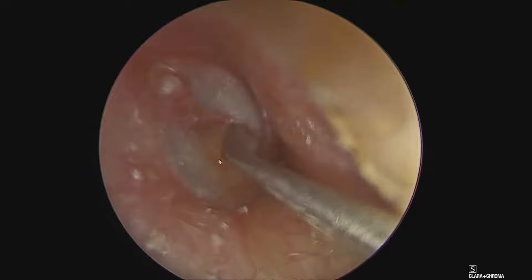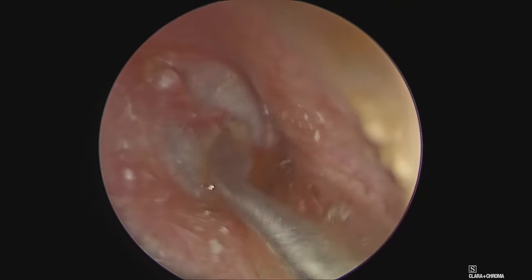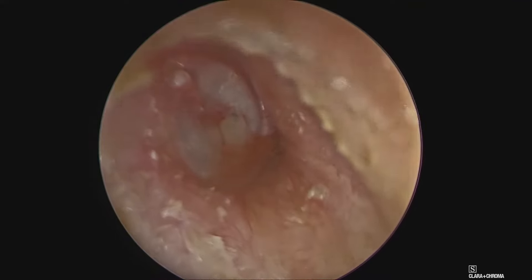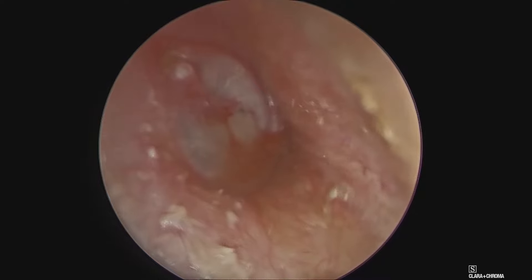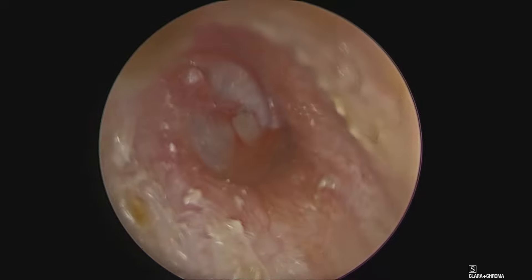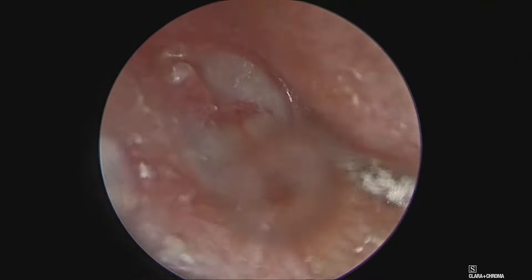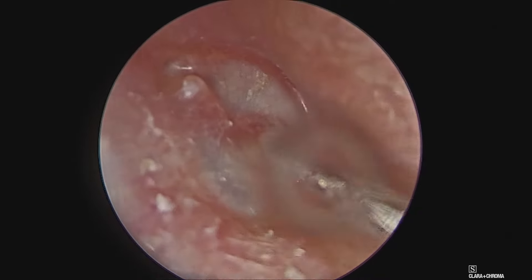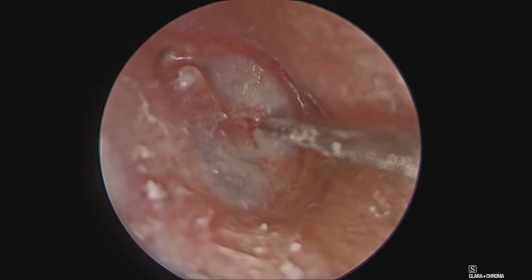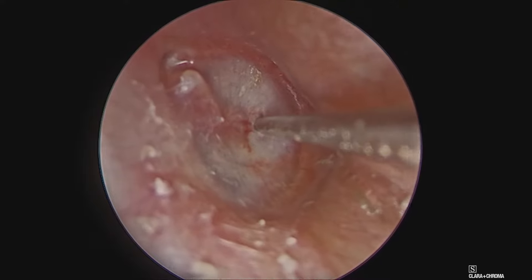You can see a straw-colored fluid coming out from the incision site. The suction removal of this fluid is being done. You can appreciate the movement of the fluid within the middle ear behind this translucent tympanic membrane as the fluid is being sucked out.